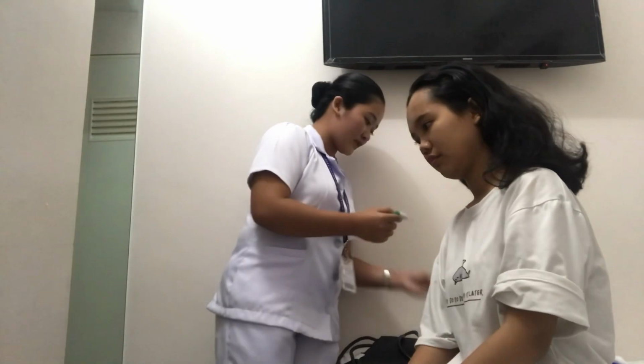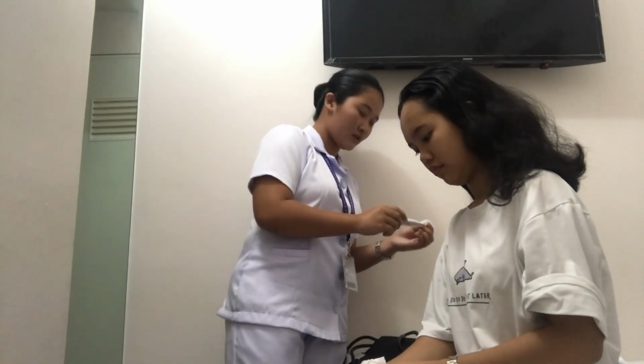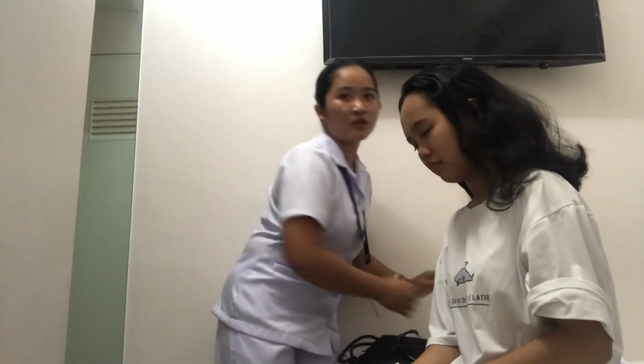Okay. So ma'am, your temperature is 36.4, which is within the normal range. So now I'm going to disinfect the thermometer that I used and place it back. Then I'm going to perform hand hygiene. It is important to know that axillary temperature is 1 degree lower than the oral temperature. Then I'm going to document the data that I've gathered in the patient's TPR sheet.